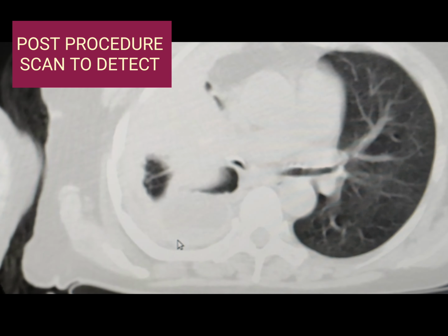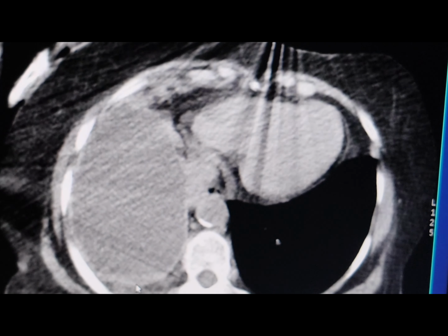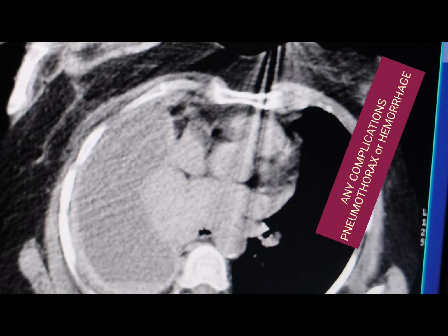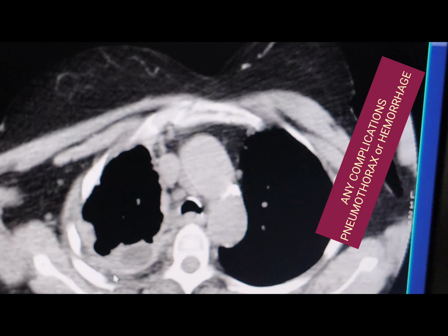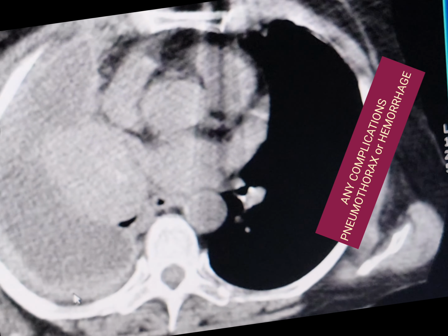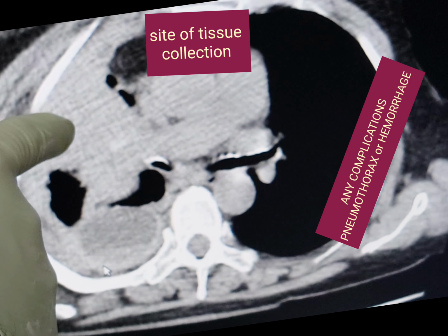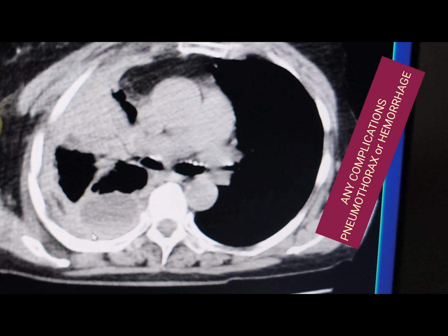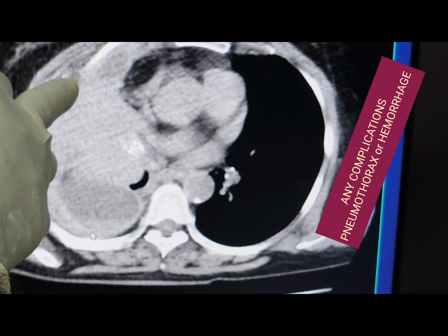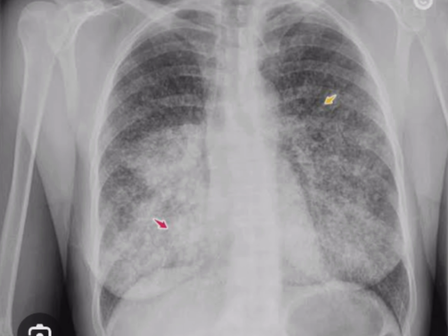After doing the biopsy and aspiration of fluid, we have to check if there is any pneumothorax or hematoma or any problem, any injury to vessels. We can see there is reduction in the fluid content, and there are markings for the collection of tissue cores. There are vacant areas on the solid areas, and everything is okay, so we discharge the patient.